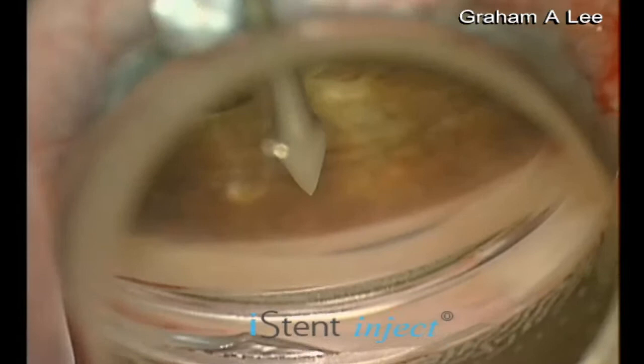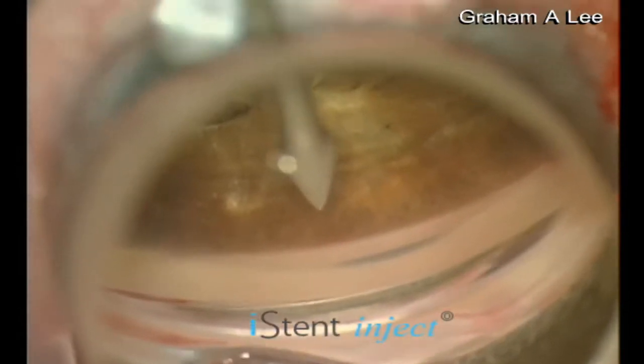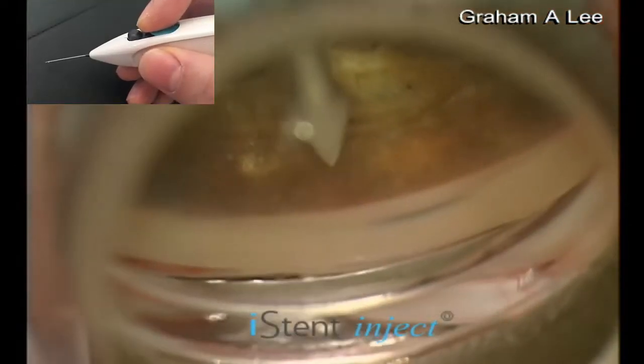The 23-gauge sheath is inserted into the eye. The blue button retracts the sheath to reveal the trocar.